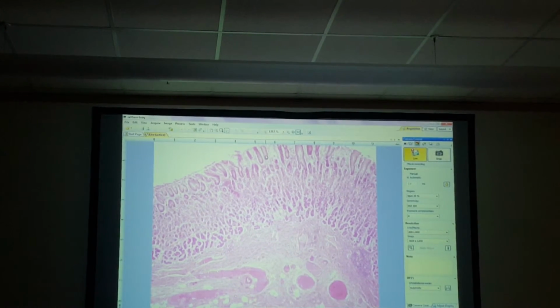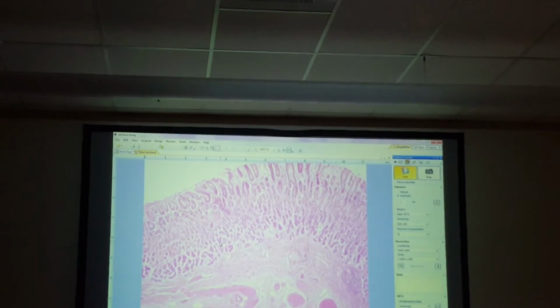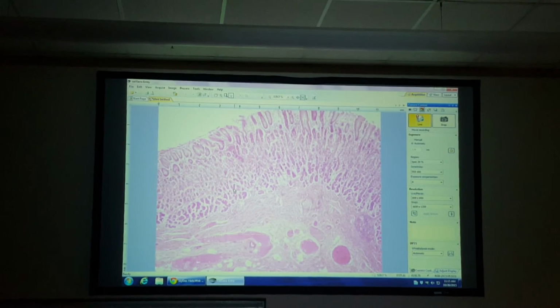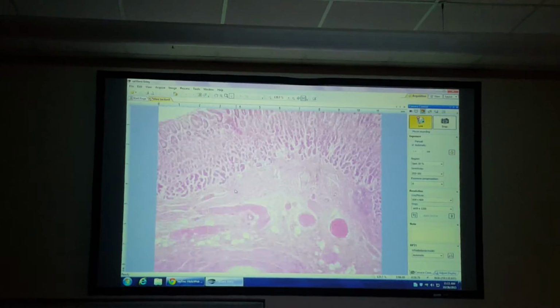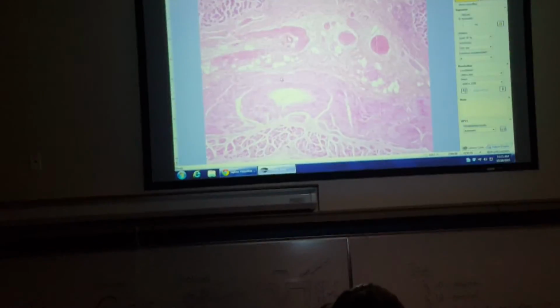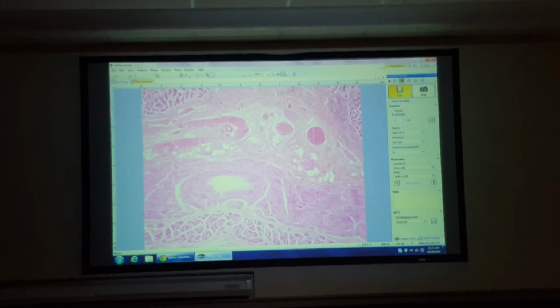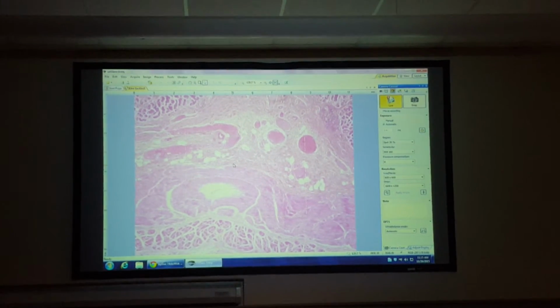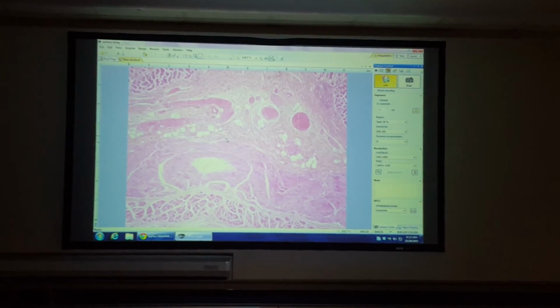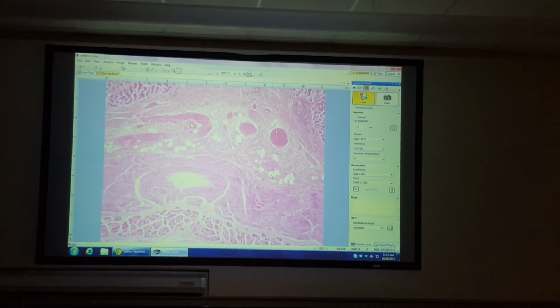What structure is this? Gastric pit. Gastric pit. What structure is this? Gastric gland. Yeah? Okay, so now let's cruise down a little bit. So if I'm looking here, again, remember this was the muscularis mucosa, we just saw that. Then from here to here, that would be submucosa. Because I'm seeing all those blood vessels, I'm seeing some adipose mixed in there. It's a connective tissue bed.